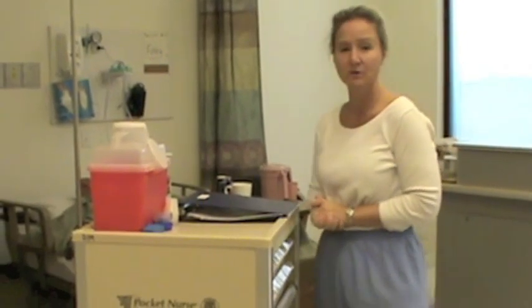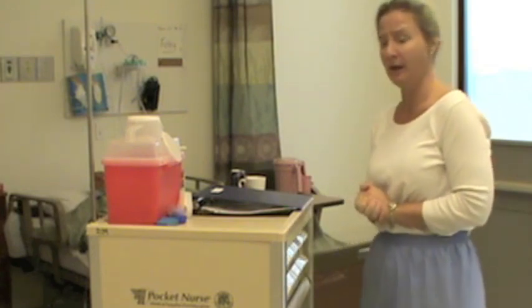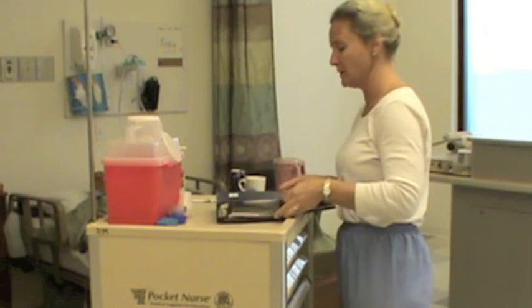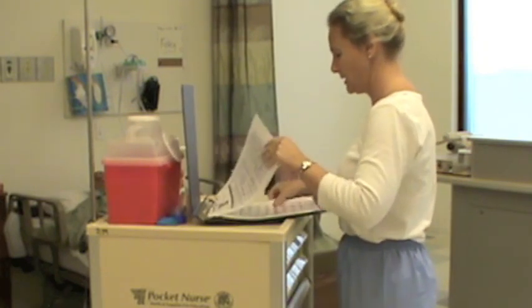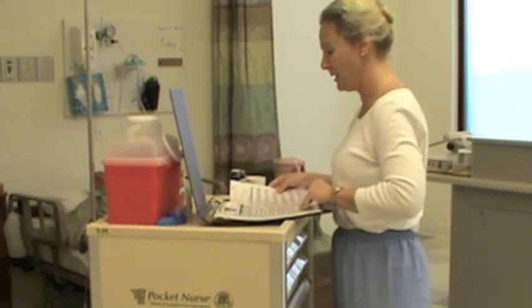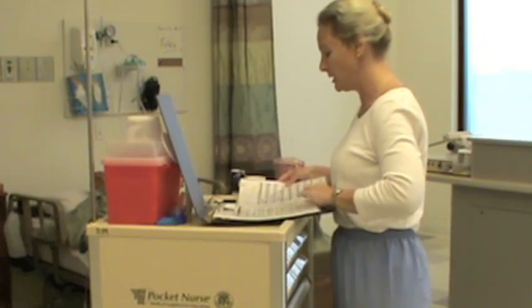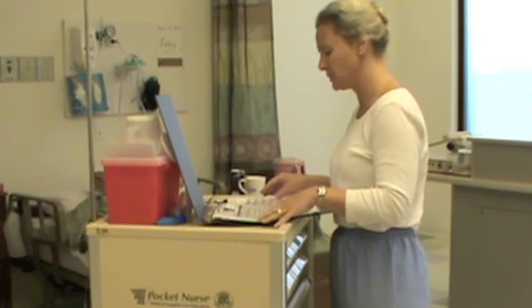I have a patient, Mr. Hoshi Ito, who is receiving 0.9% sodium chloride at 120 mL per hour. His IV solution is almost finished and the tubing is due to be changed. I'm going to take Mr. Ito's chart and confirm that the patient is receiving the correct fluids at the correct rate, comparing my IV flow record against my physician's orders.